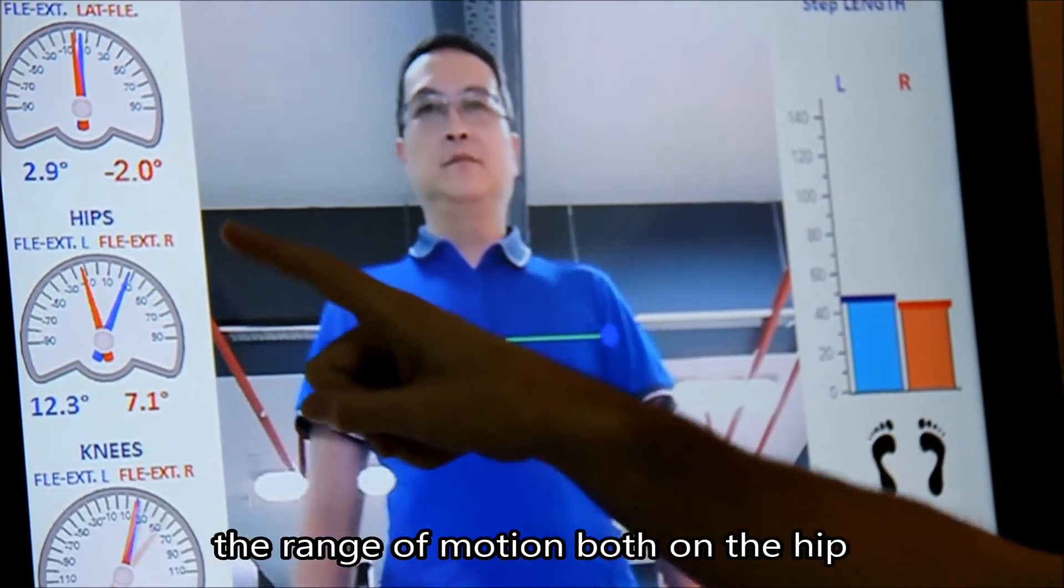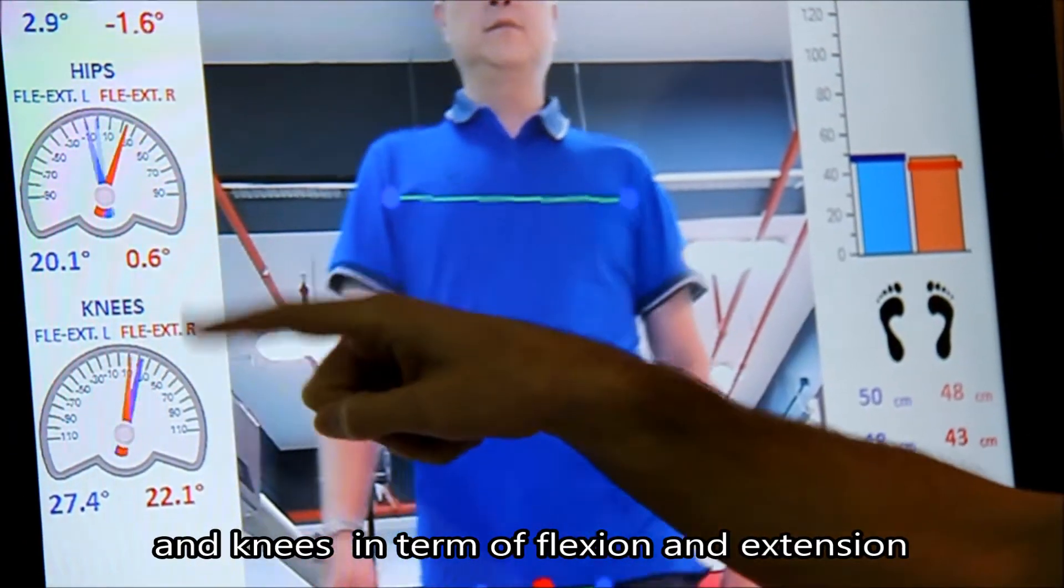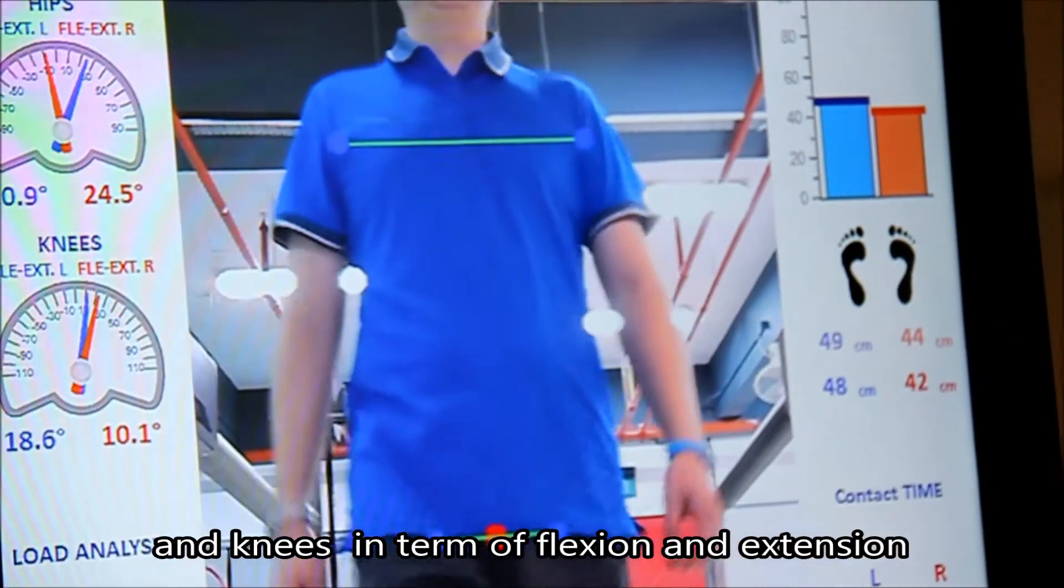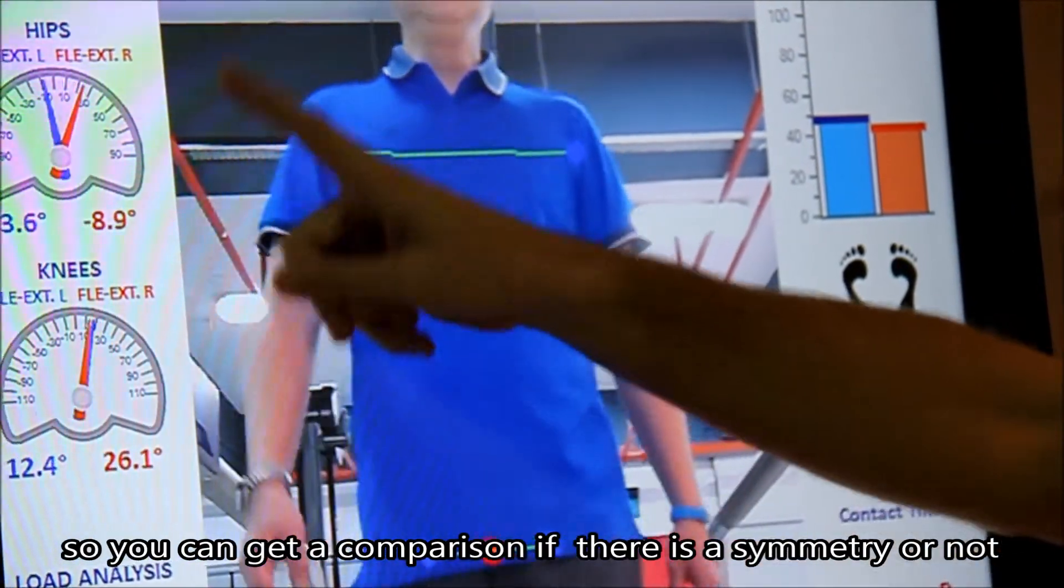We can understand then the range of motion, both of the hips and the knees, in terms of flexion, extension. So we can get a comparison. We can see if there is a symmetry or not.